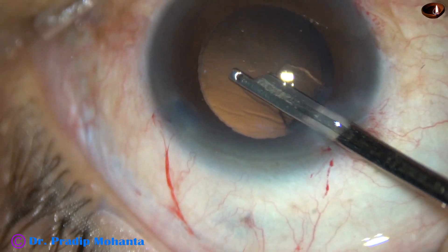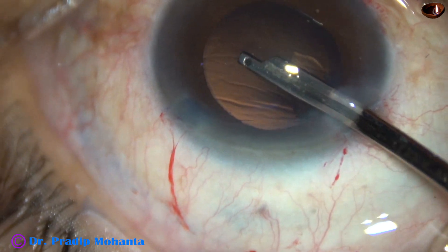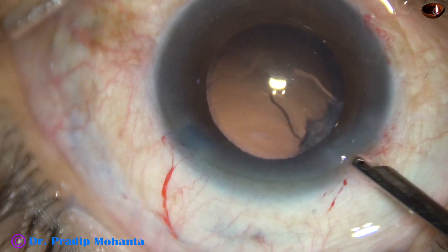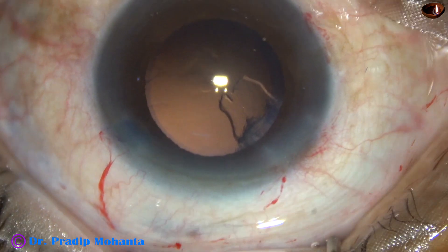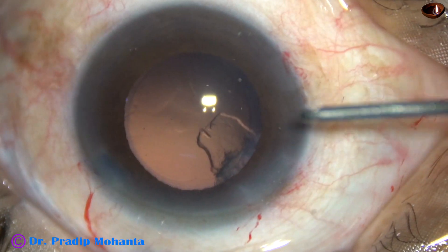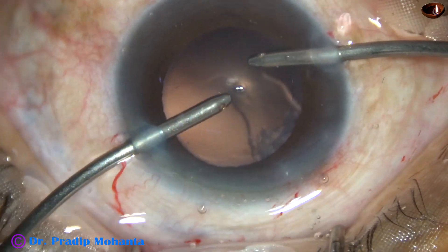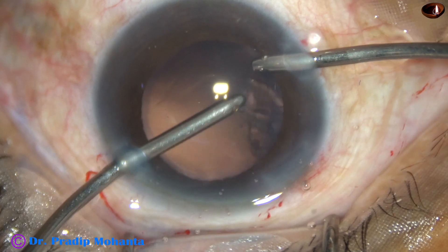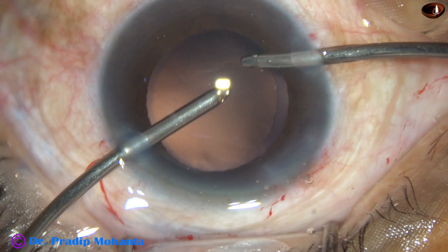And by this time, the assistant is ready with bimanual irrigation aspiration. She has got enough time to make bimanual irrigation aspiration ready for you. And now, take the bimanual IA and remove the sub-incisional cortex. And it is done — the sub-incisional cortex has come out.